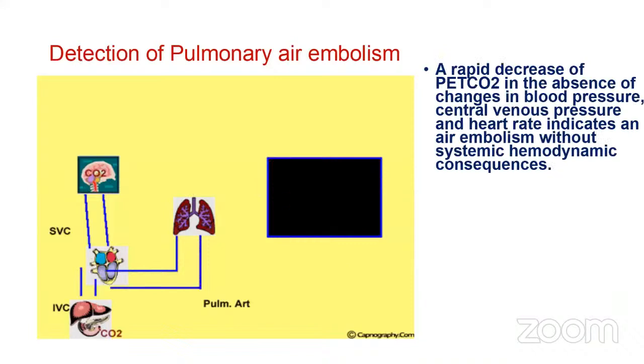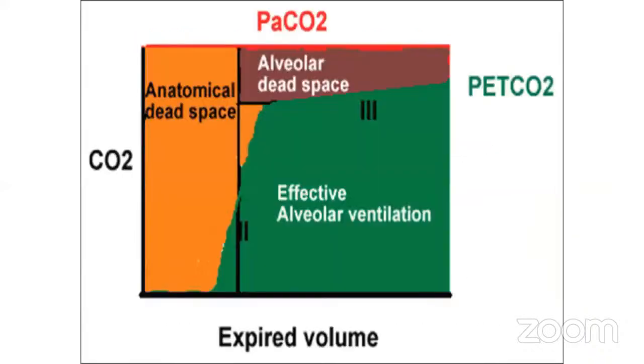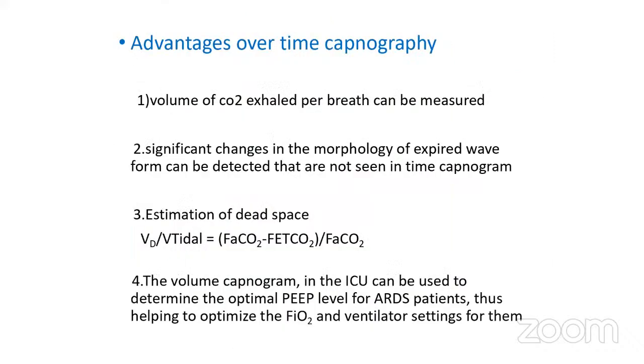Sir, I think the fraction of expired air, that is carbon dioxide, sir. FeCO2, a fraction of expired air, that is carbon dioxide. This one. No. Back slide. Yeah, this one. VD by VT. Dead space versus tidal volume is equal to the partial pressure of carbon dioxide minus the end tidal carbon dioxide. Because different books are using different things, no?